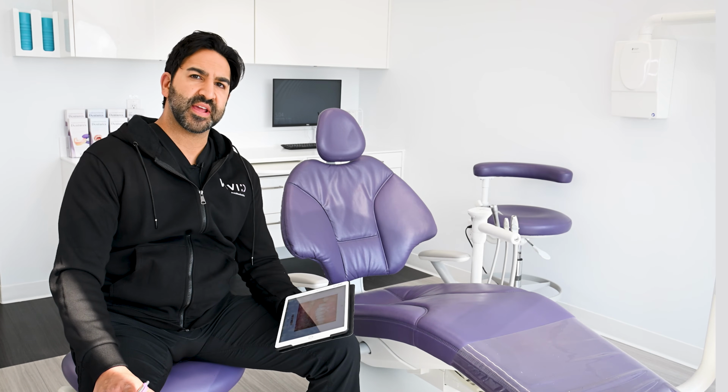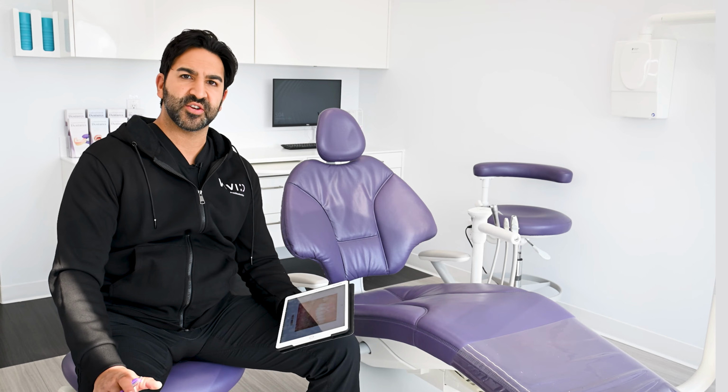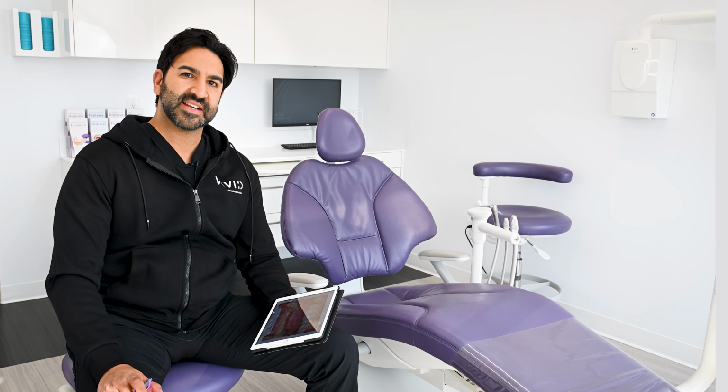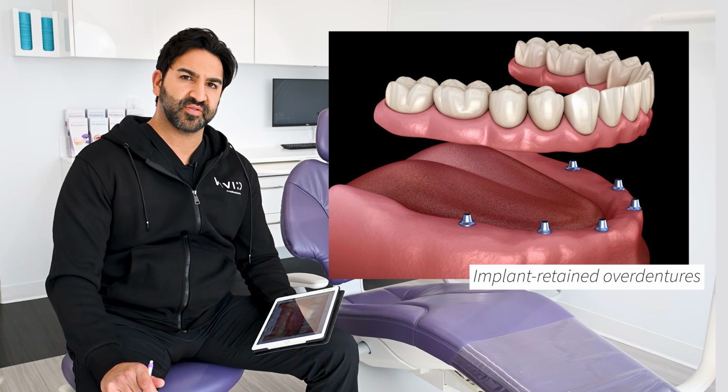In this particular case, the patient had dental burnout and was not interested in trying to attempt to save her teeth again. Because of her genetic condition, we decided to be a little bit more aggressive with her treatment plan. We decided to remove the remaining maxillary and mandibular dentition and to utilize dental implants to support implant-retained overdentures.